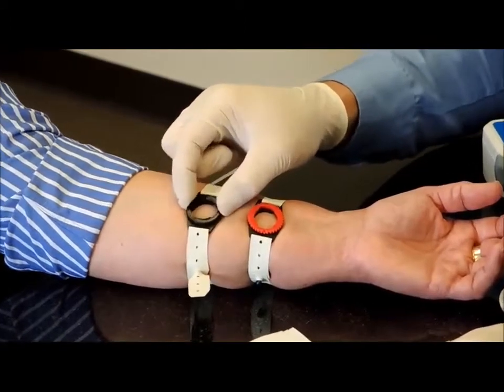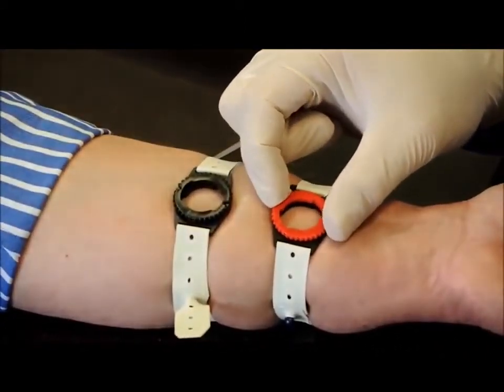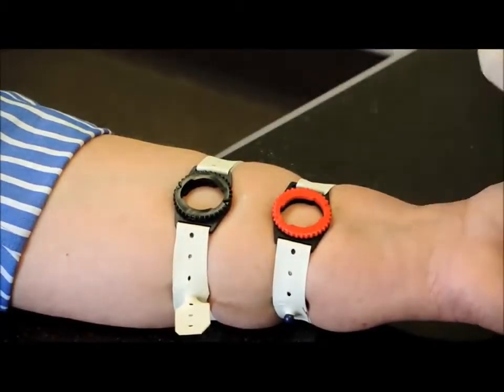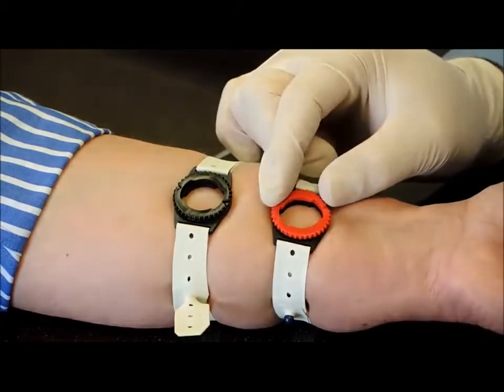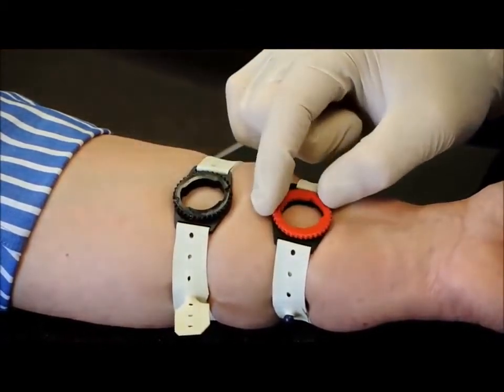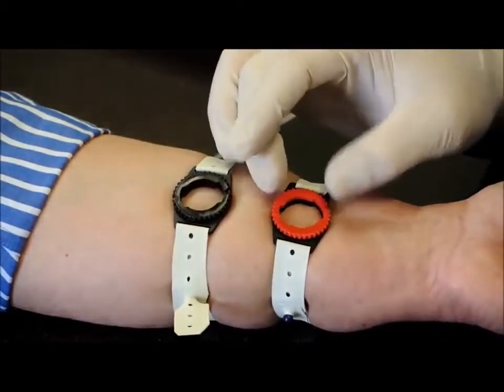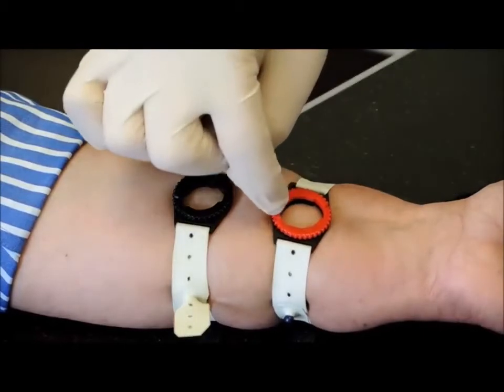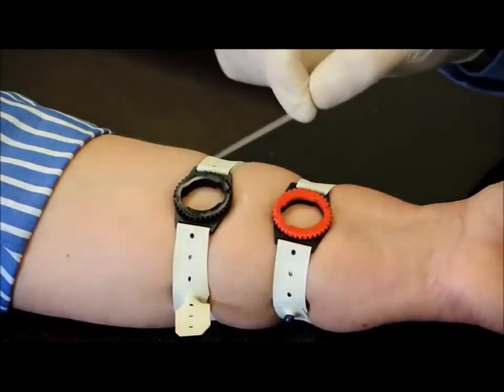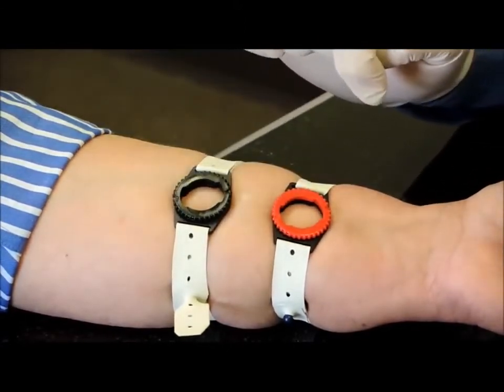And the top part, there's a ring that turns, okay? That ring is what's going to lock the electrodes into place, and also the sensor cell when we're ready for that. And so make sure that that turns freely, and when you observe that it turns freely, line it up so that the depressions or the edges of the part that turns lines up with the same depressions that's on the bottom part of the holder.